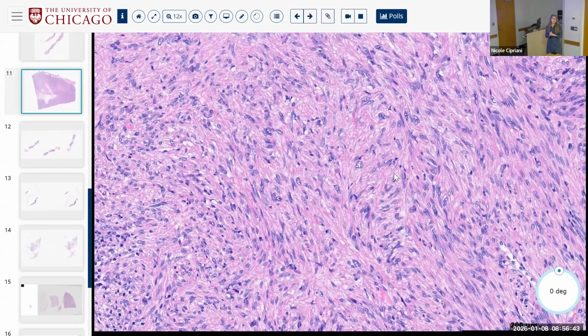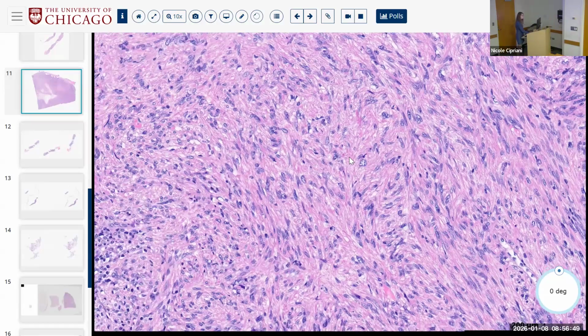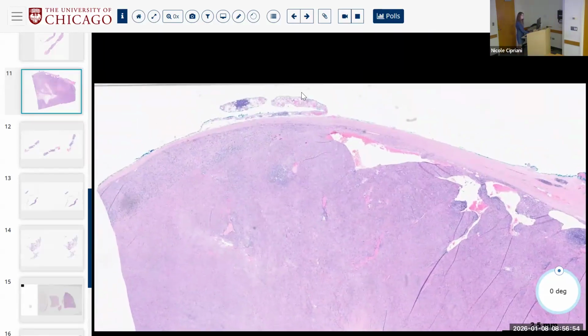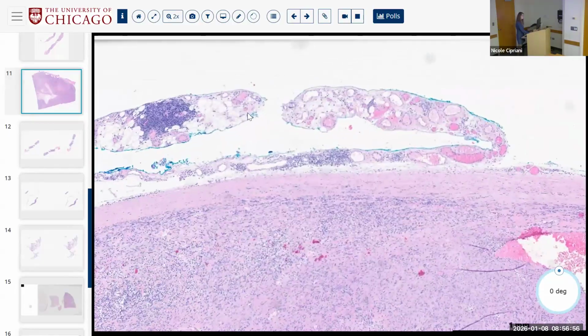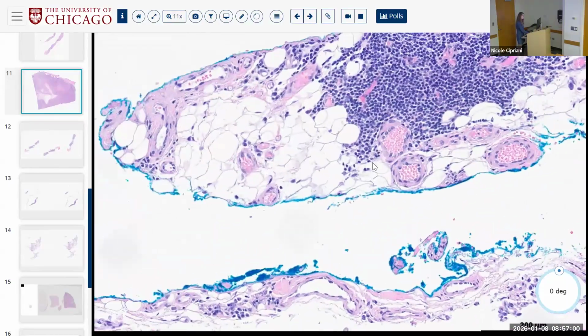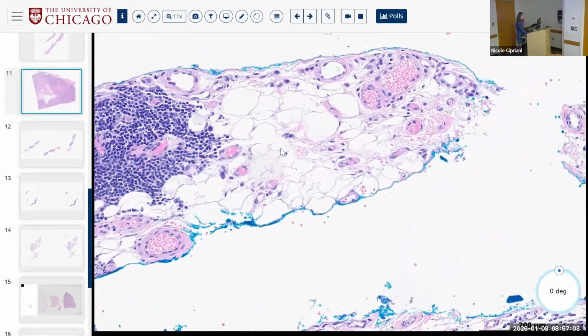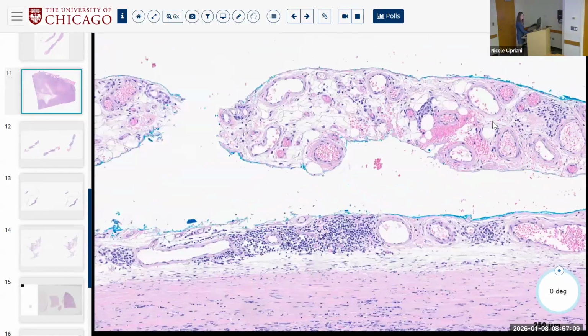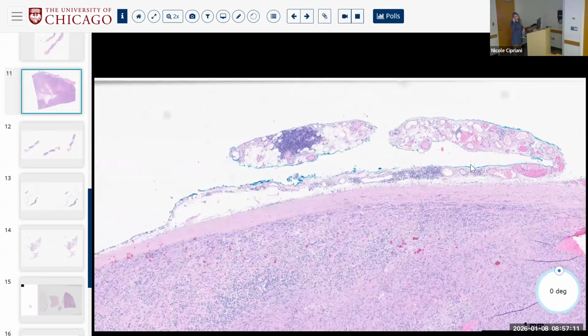So you have to ask yourself, is this really a liposarcoma, and look for potential background fatty tissue. In this case, I don't think they sent much background fat, so it would be very hard to evaluate, but things like this start to raise the possibility. Maybe you throw an MDM2 IHC on here and see what happens. So my lesson learned here is always just do an MDM2.